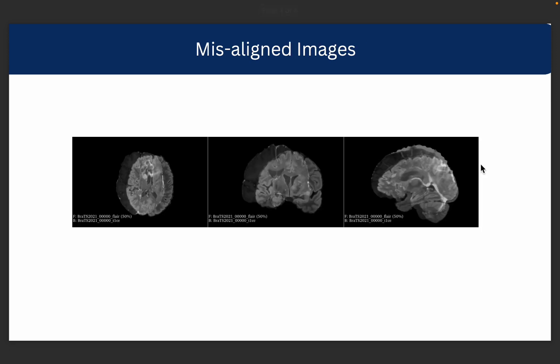As you can see in this example, I have overlaid two different images — FLAIR and T1CE of the same patient — and they are not properly aligned. This will create a lot of problems when performing segmentation. The tumor region in one MRI is in a different position compared to the other. These are not properly aligned and the system will get confused. This is the case we often come across when working with real-world data.